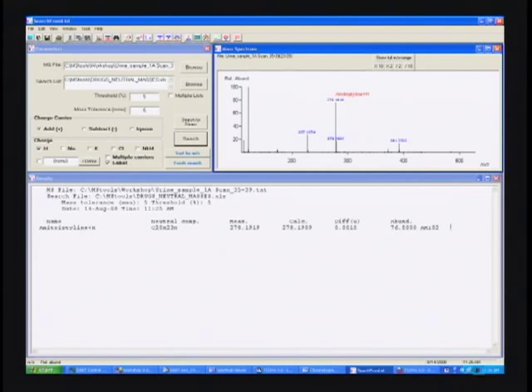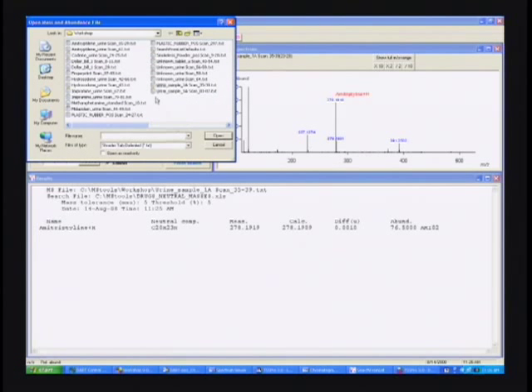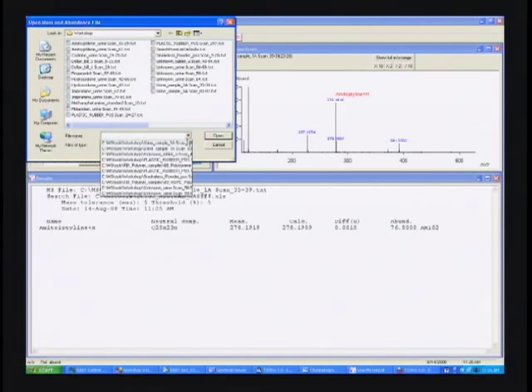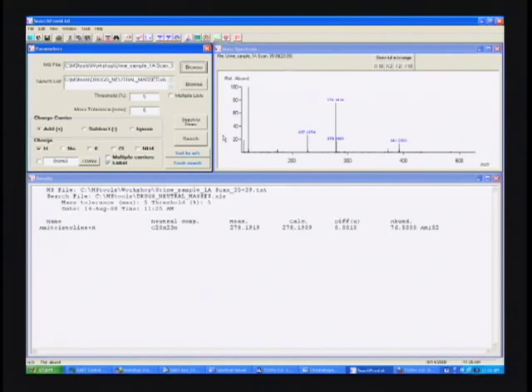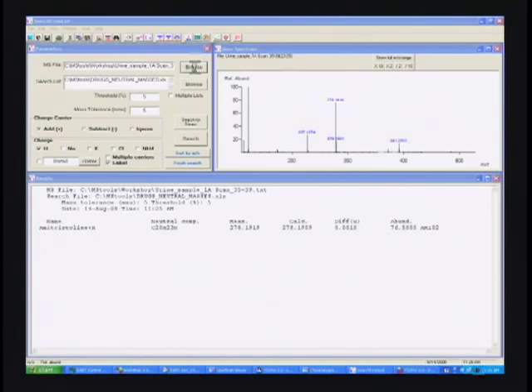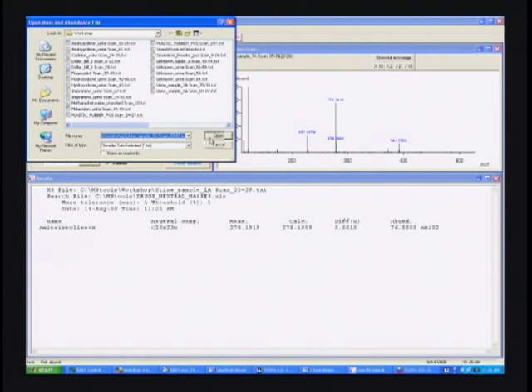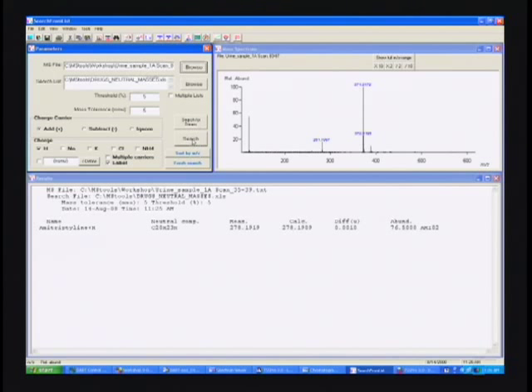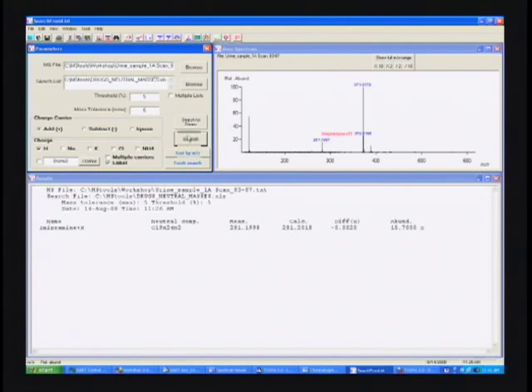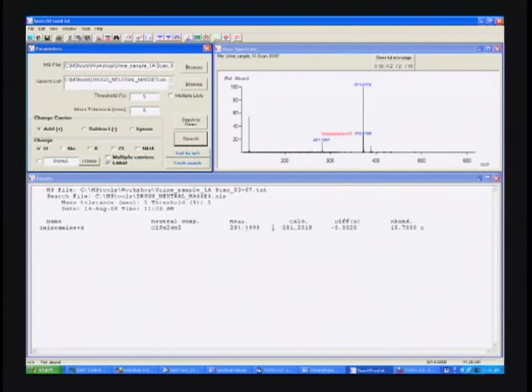Let's take a look at the other spectrum. We'll search this one, see what it comes up with. Imipramine, two parts per million mass units. There aren't any isomers of that in the search list, so we only see one entry. If there were, we'd see multiple entries and we'd have to decide which one it is from some other information. A sample like that has codeine, hydrocodone in it, that would be more that situation. We wouldn't know exactly which one it was. We just know that it was one of those.